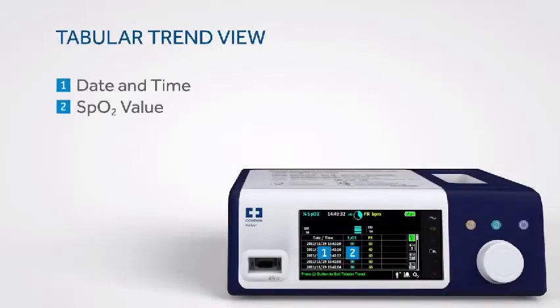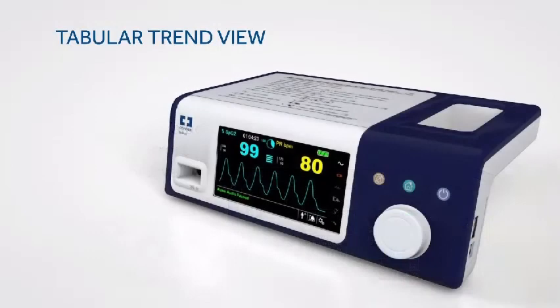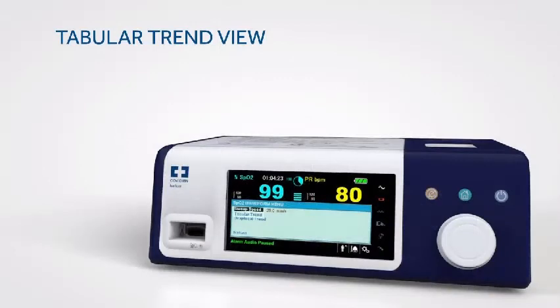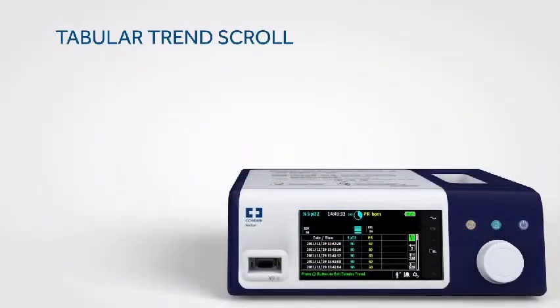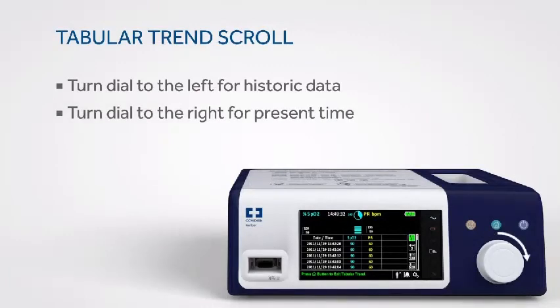The monitoring system presents trend information in tabular format for all monitored parameters when you enable this option. To access the tabular trend view, rotate the jog dial to highlight the waveform or trend display area and press. Select Tabular Trend and press again. To scroll through the tabular trend view, rotate the jog dial to the left for historical data or to the right to get back to present time.